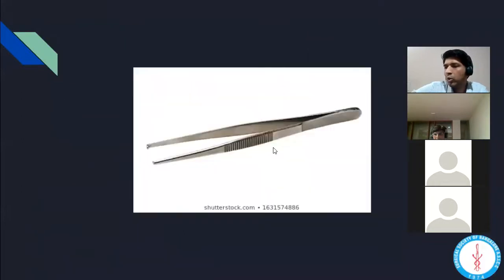Then you have the tissue holding forceps or the thumb forceps. Again, you can have it with tooth or without tooth. And all these tissue holding forceps come with a preloaded spring action. You can see that when I press, it compresses, and when I release, it opens. So this is called a preloaded spring action.